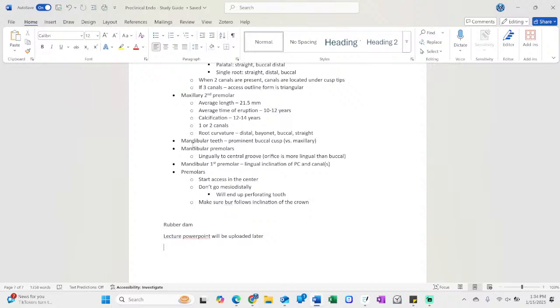Do they have those rubber dams with the white paint around them that is all in one? No. So they make these rubber dams that you may have seen, that have, I don't know if it's plastic or what it is, around the outside, and it's supposed to act as frame and rubber dam in one. I found they're okay for anteriors, but they never work for posteriors. Using the traditional rubber dam in the frame is much better.